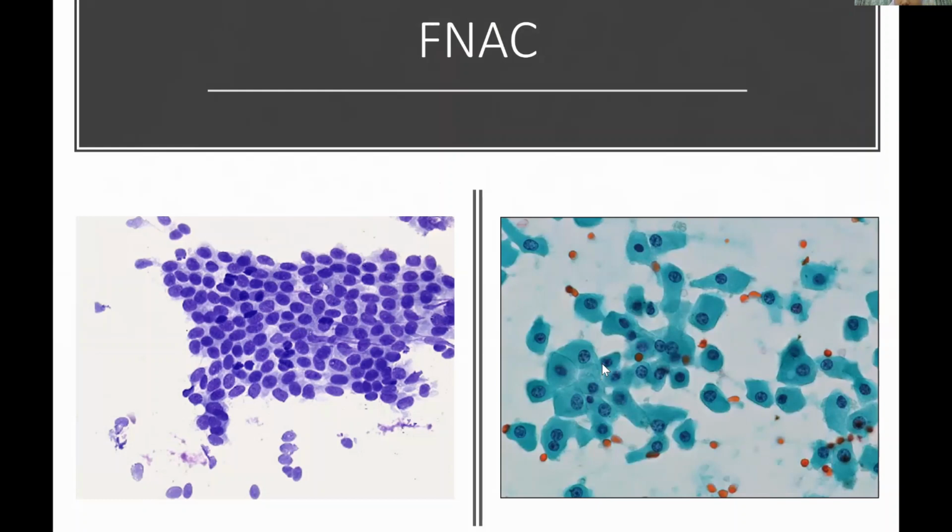Okay, so this is a PAP stain. Actually, this is apocrine cells. In breast disease, for example in fibrocystic changes, you can see the duct become cystically dilated and lined by apocrine metaplasia. So this is how the apocrine cell looks. This is a nucleus. They have abundant granular cytoplasm. You can see they have something inside the cytoplasm, granules. It's abundant and granular.